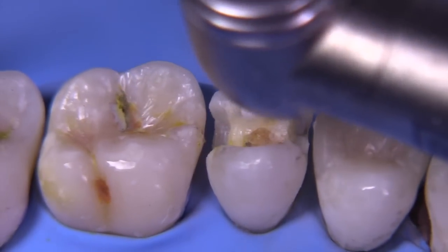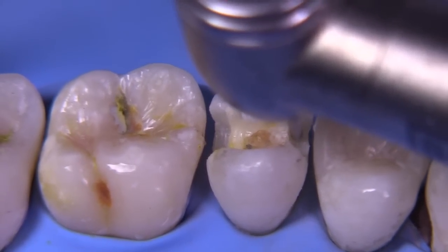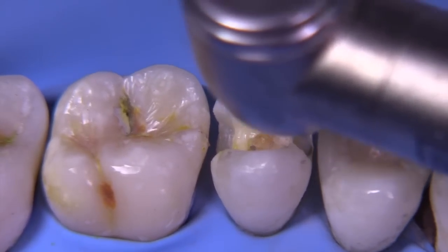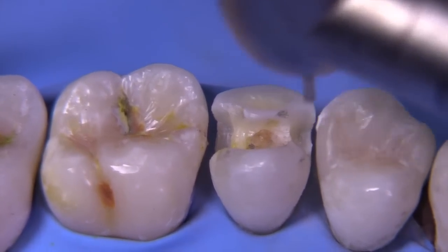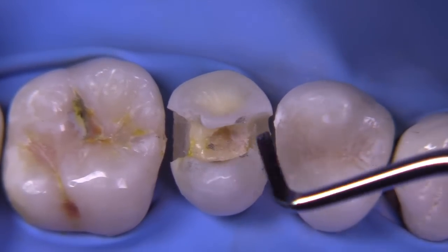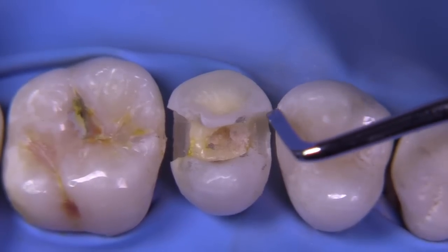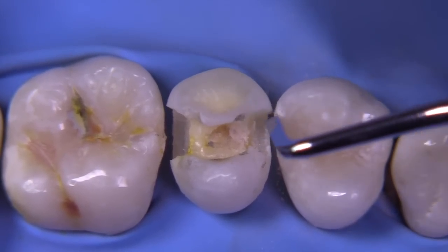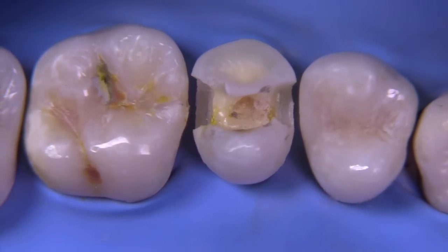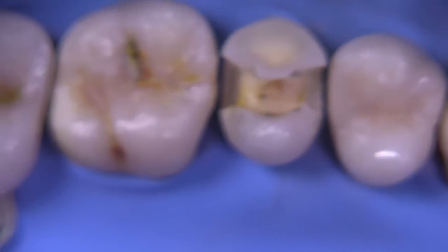At this point, it's important to remember to refine those boxes as best as you can before you go into the caries removal in the deeper areas, because we want to make sure we've established a good outline form with good resistance and retention form before we move on to caries removal. I know it's tempting to go after all the caries first, and sometimes that is necessary, but in this particular case, getting that MOD preparation completed before we go after that cusp makes a lot of sense.